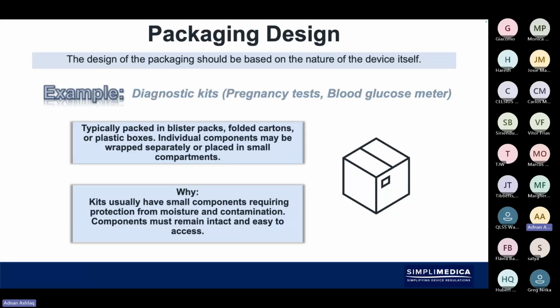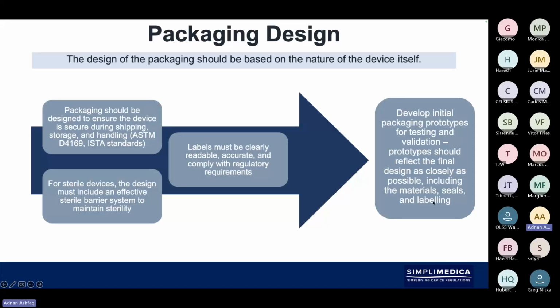One of the other things to consider when you're looking at the packaging design is that you may also have the instructions for use or labels or any additional materials that will be packaged alongside the device itself. That also needs to be considered as part of the packaging. And when we come on to the actual packaging design for the shipping testing, you also need to include that as part of the tests. So when you're designing it, ensure that it's going to be compliant with the testing requirements of the ASTM standards.